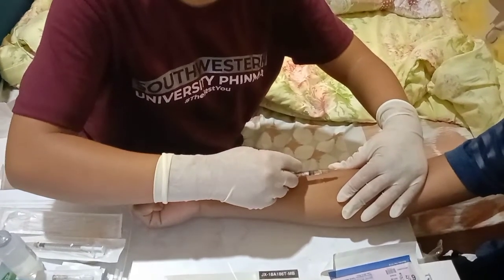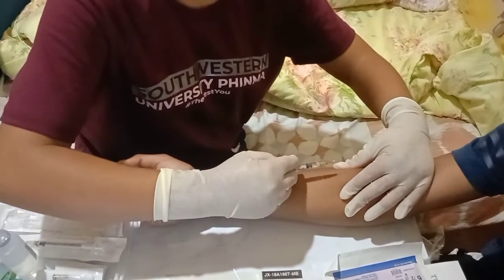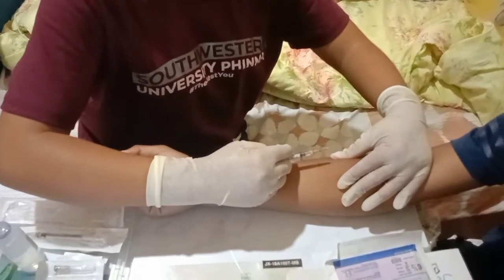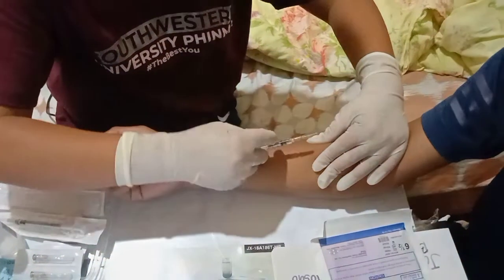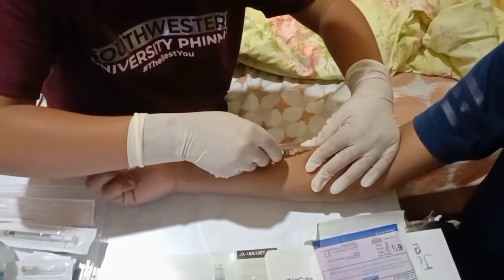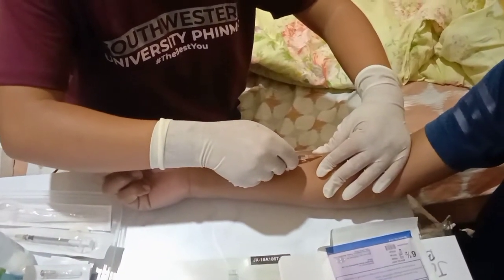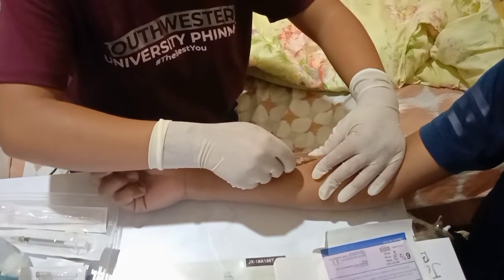Next is to inject the fluid. With the non-dominant hand, pull the skin at the site until it is taut. Insert the tip of the needle far enough to place the bevel through the epidermis into the dermis. The outline of the bevel should be visible under the skin surface. Wait 5 seconds to stabilize the syringe and needle. Inject the medication carefully and slowly so that it produces a small wheal on the skin.